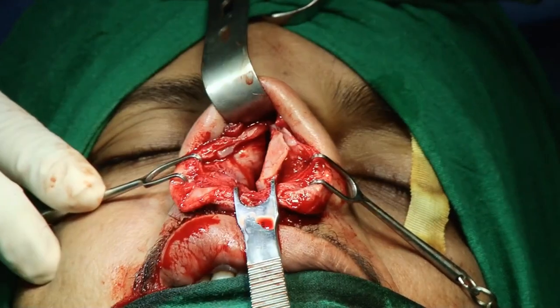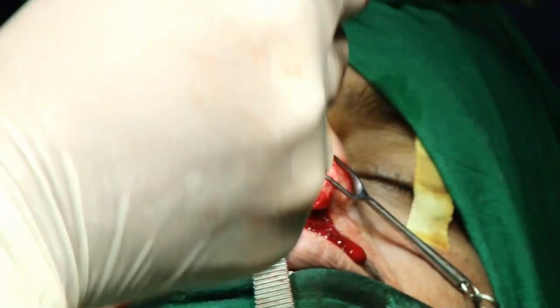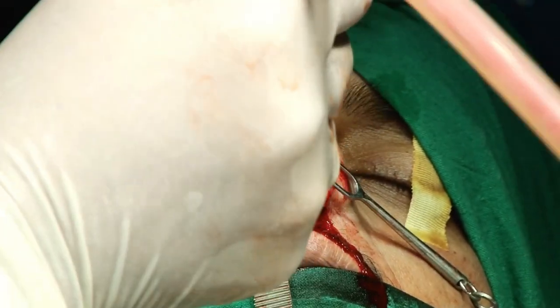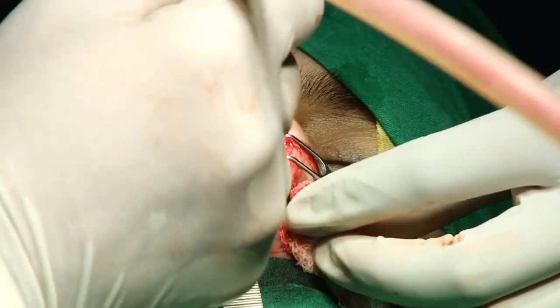Okay. Now give me the septum. Now I take the rest of the deviated part of the septum, because the deviated part I still need to correct.